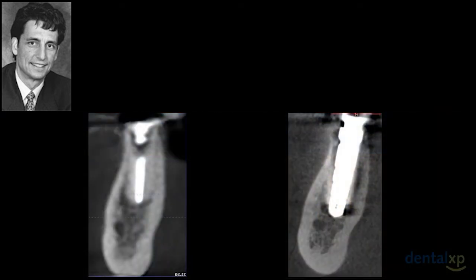This is a case where we took an intraoperative CT scan on an immediate, and so you can see that we're getting close. As was shown earlier this morning, with the appropriate burrs, we can start pushing the limits. We've now got the imaging, we've got the burrs, you can also use the piezo, and what that allows you to do is encroach a little closer on the nerve than you might have otherwise. Normally, when you have this small amount of bone to engage for immediate, it's very difficult.